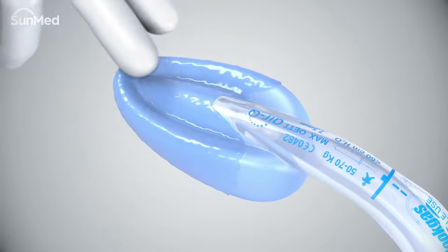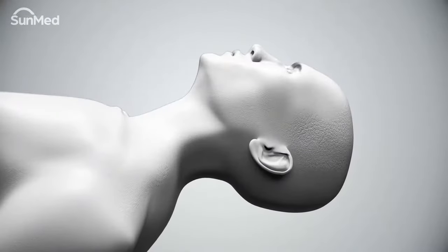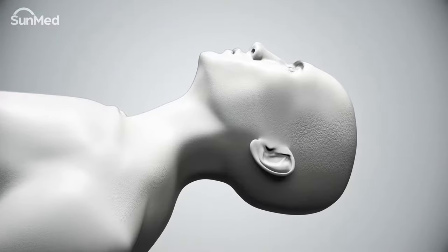Use a water-soluble lubricant to lubricate the mask's external surfaces and ridges. Avoid placing lubricant on the bowl of the mask. Inspect the patient's mouth and remove all removable denture devices.